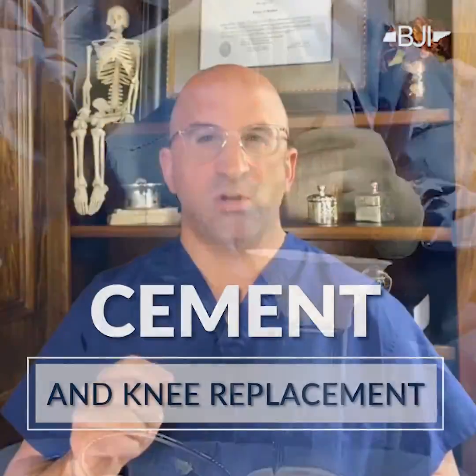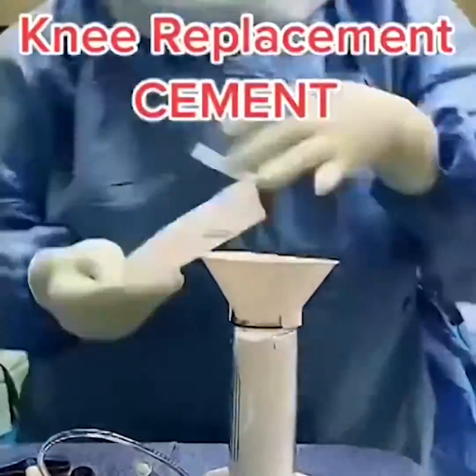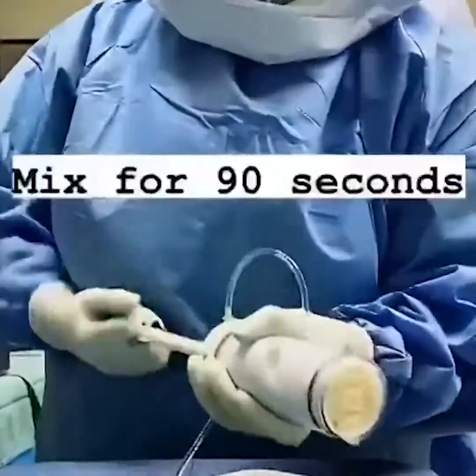Sometimes we place these parts with cement. What I mean by that is we take a powder at the time of surgery, mix it with a liquid called a monomer. We then place that doughy substance on the bone — this is the end of the femur here — and we place that doughy substance on the back of the metal part. This is the femoral component.